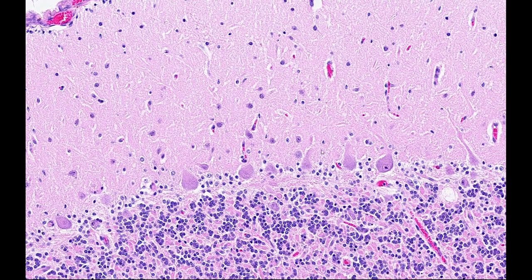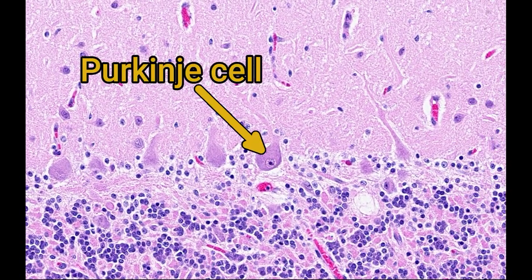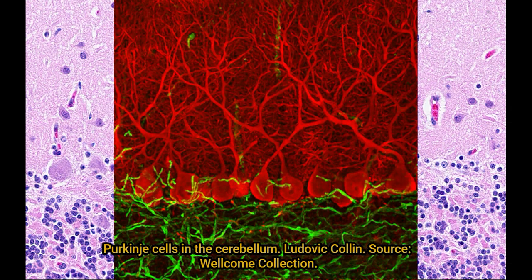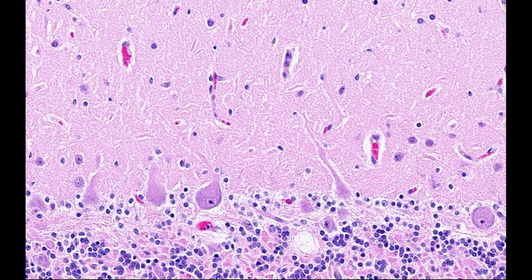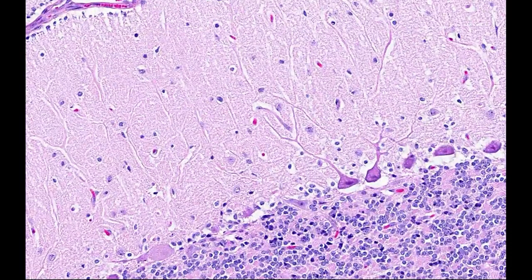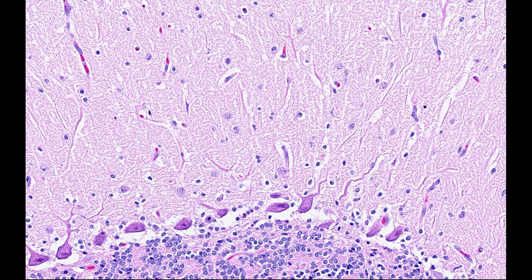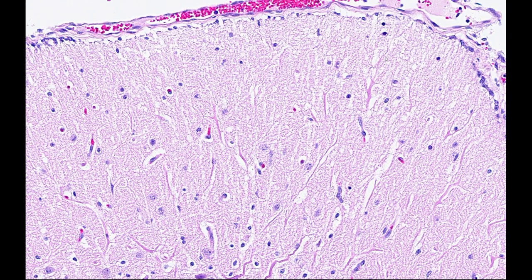Purkinje cells, which we can see in the Purkinje cell layer, are amongst the largest neurons in the brain — here's a good example of one. It has a huge cell body with a large nucleus and a single nucleolus. The distinctive feature of the Purkinje cell is their large branching dendrites that they send out into the molecular layer. You can see just a little bit of the extent of it on H&E sections, and in fact there's a good section on this slide where the Purkinje cells are very condensed and you can see their dendrites forming these huge branching networks all the way up into the top of the molecular layer.